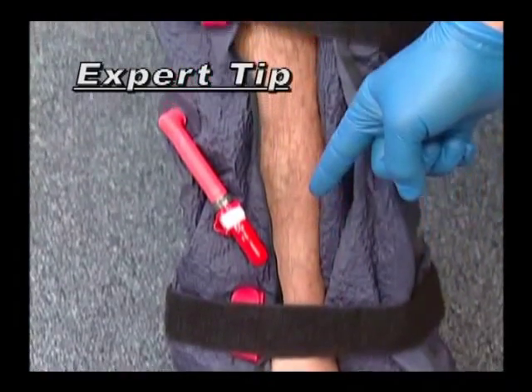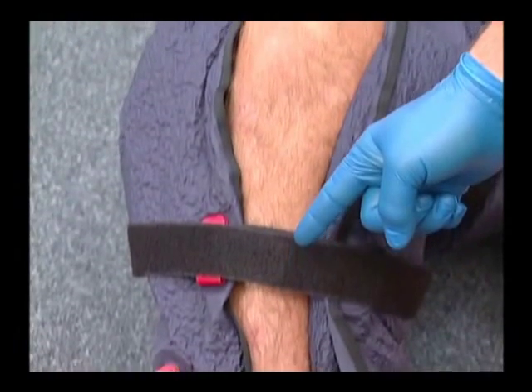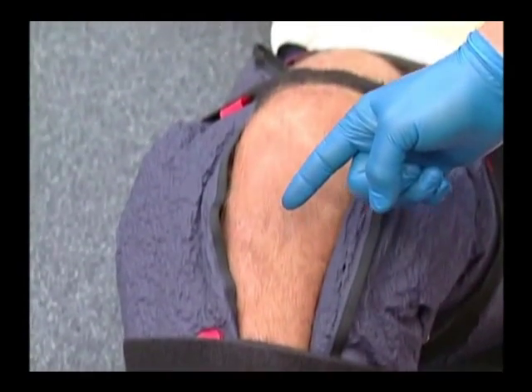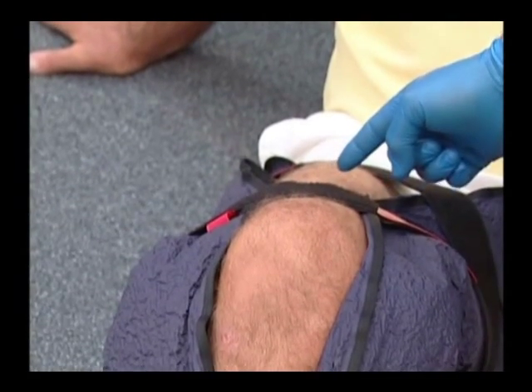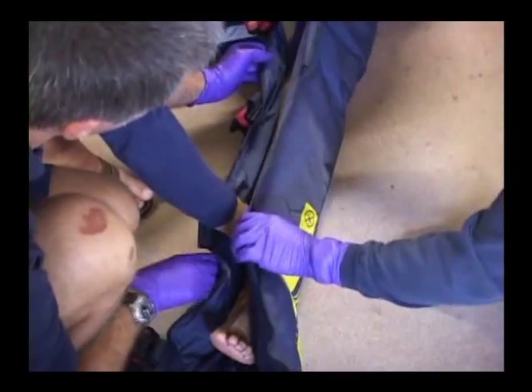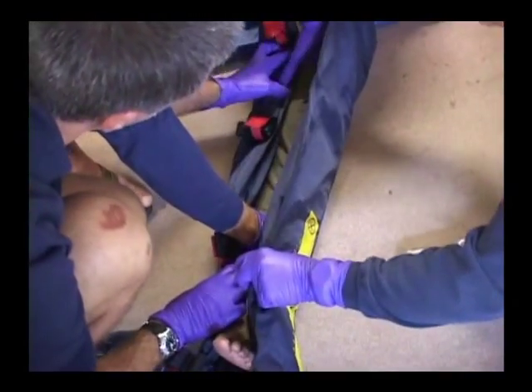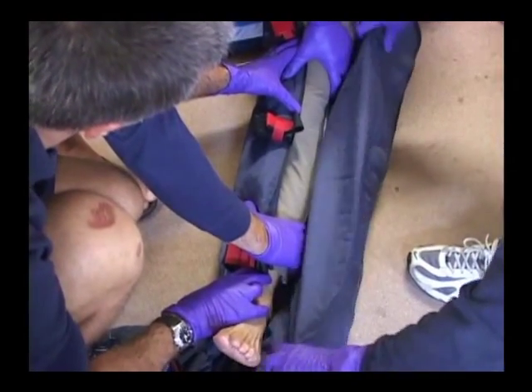Leave an open space approximately one inch whenever possible along the length of the splint. This provides proper immobilization yet also allows for visual inspection along the full length of the injured extremity. If the splint is too wide, fold the strapless edge back on itself and smooth out the edge to form a narrower splint.